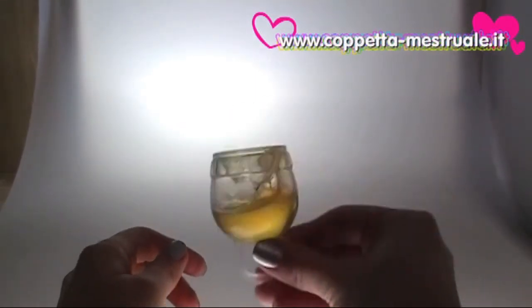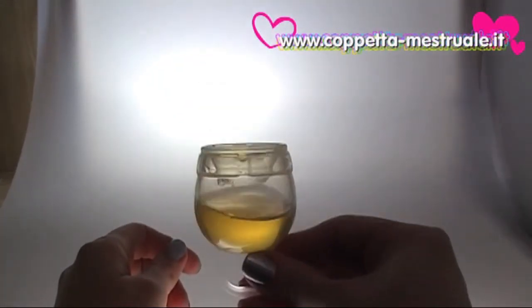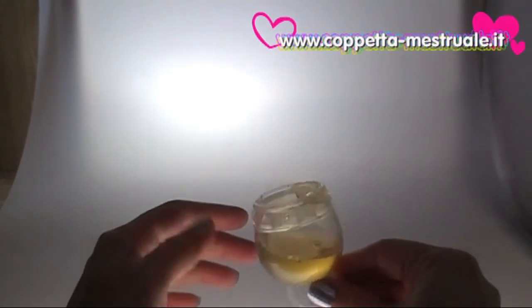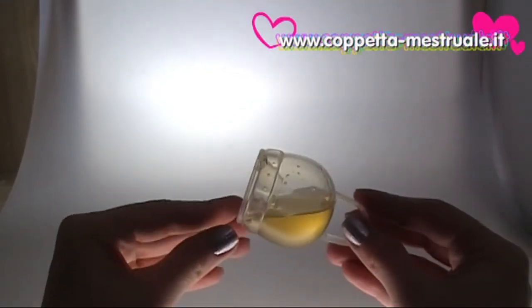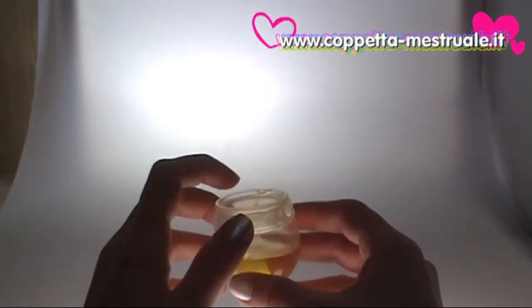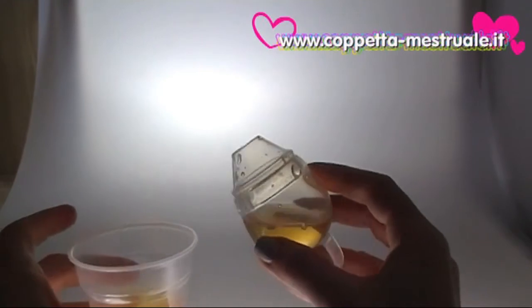And here is the great feature of this cup. Notice, after shaking and shaking, the liquid is still in the Femicycle. Also remember, this volume of liquid is more than our menstrual flow in 12 hours. To empty the cup, just open the Femicycle lid and empty its contents into the toilet.